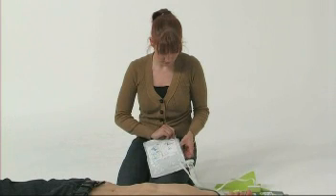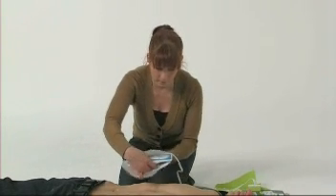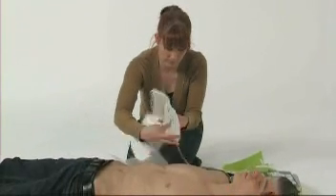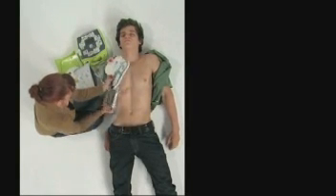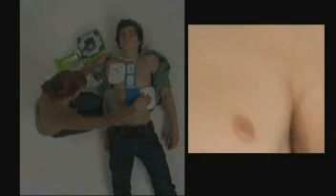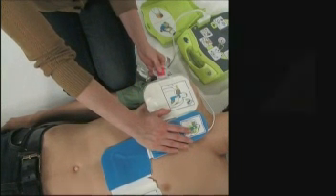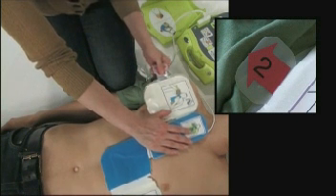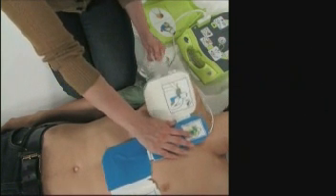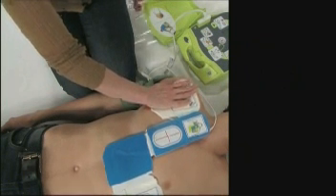Tear open the electrode pack and unfold the electrode pads. The CPR-D pads are a one-piece pad designed to be easy to place. Using the sensor's crosshairs to guide you, align the CPR landmark between the patient's nipples and the middle of their breastbone. Press the CPR landmark with your right hand and pull the number 2 tab to peel the protective backing from the electrode. Press the electrode from the centre out to make sure it adheres properly to the patient's skin.